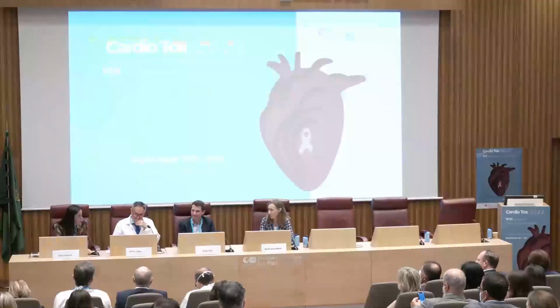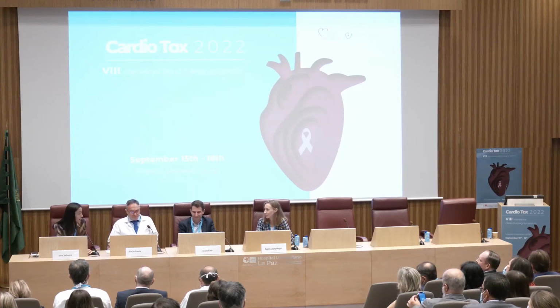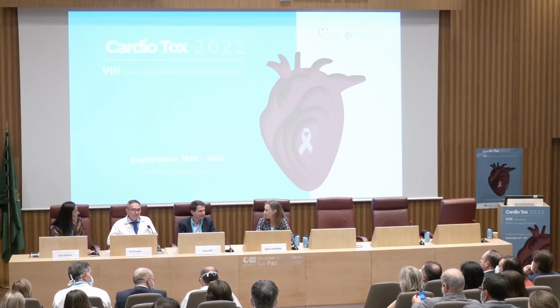Yeah, and I think an important message is also that these are different technologies, different sequences, and the 15%, for example, for echo is not applicable here. We need our own threshold for this technology. For sure. Maybe it can be lower.